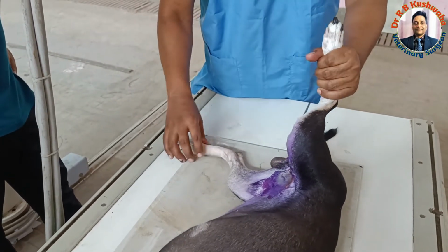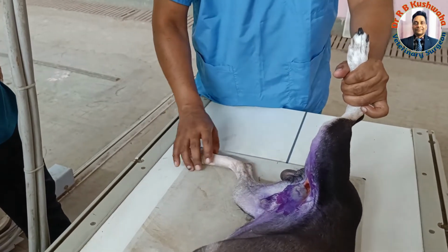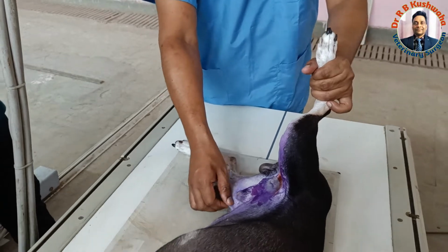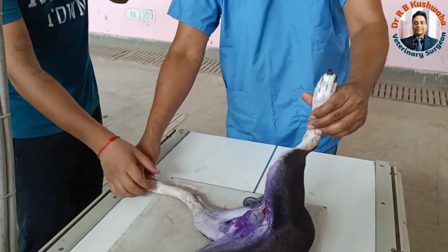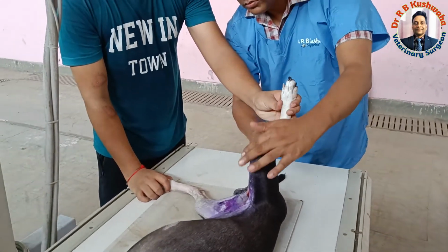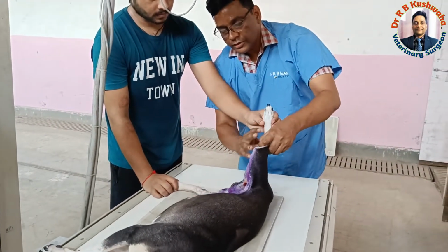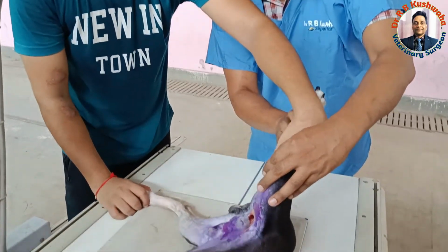I have sedated this animal deliberately because there is pain, just to reduce the pain and also make the exposure very easy. So kindly hold like this, okay. We try to pull this contralateral limb away as far as possible.